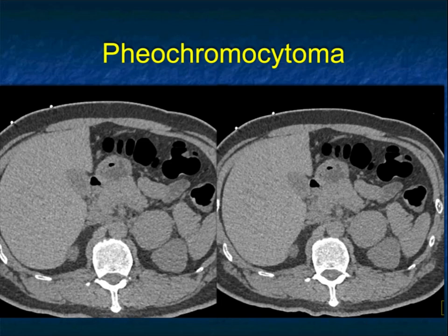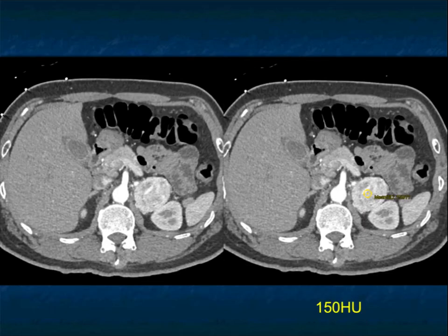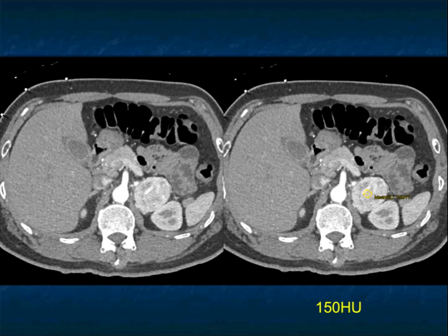On non-contrast scans, there's not much to say about this left adrenal mass — it's denser than the kidney, not a classic adenoma, no fat, but it could be a lipid-poor adenoma, a met, or a pheo. It measured 42 Hounsfield units non-contrast. With contrast it enhances as a hypervascular lesion to 150 Hounsfield units. The rule is anything enhancing above 130 — we used to say 120 — is a pheochromocytoma until proven otherwise. The only thing that can fool you is a vascular met from clear cell renal cell carcinoma.